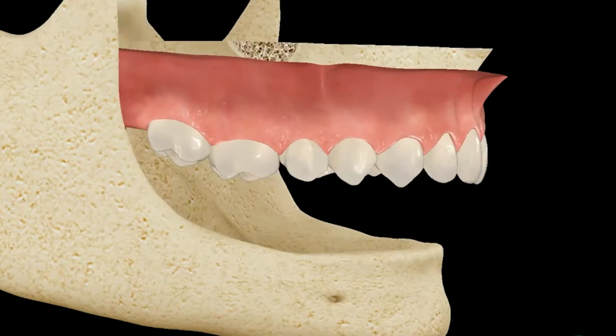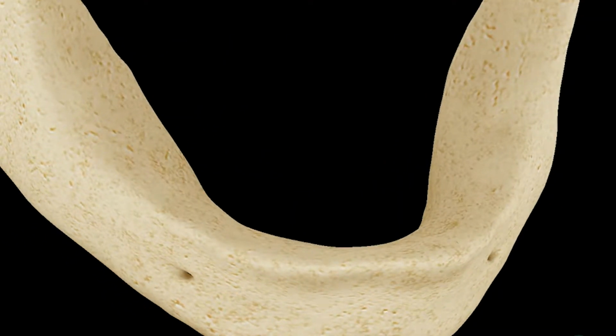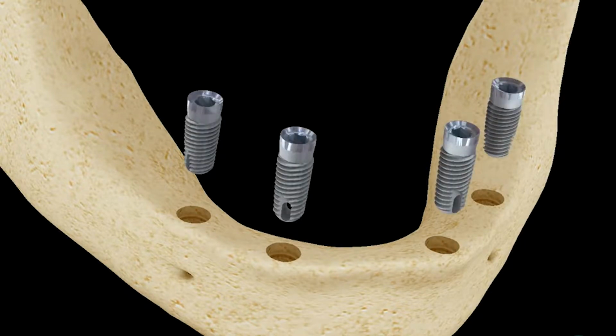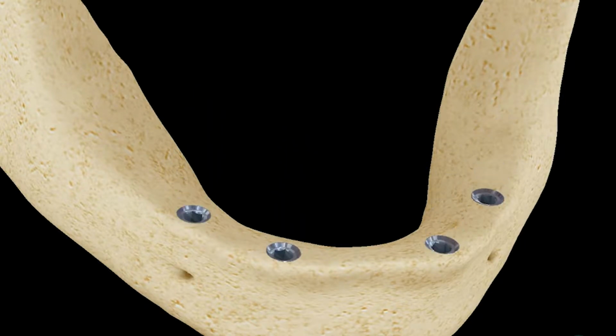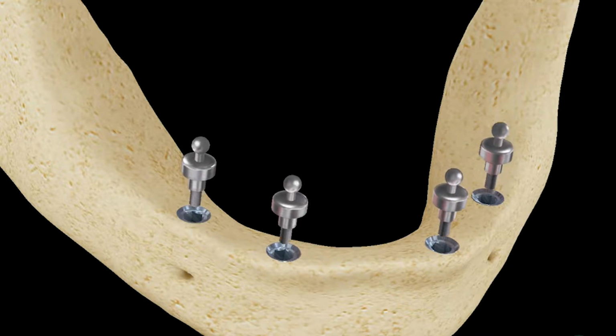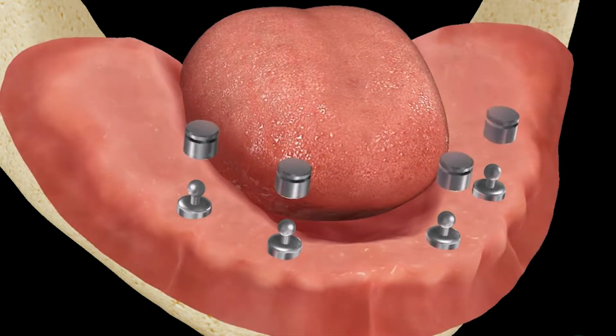An option for people that have dentures that slip and slide or don't have adequate bone to hold a denture in properly is an implant-supported denture or an implant-supported prosthesis. So a fixed prosthetic is either made with all porcelain or it's made with a titanium bar and denture teeth. Depending on the situation, you have to make the right choices for the right people.